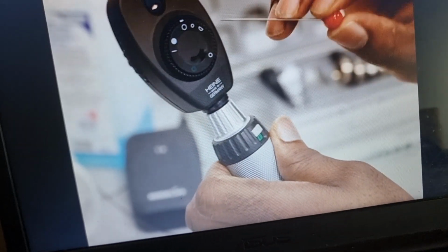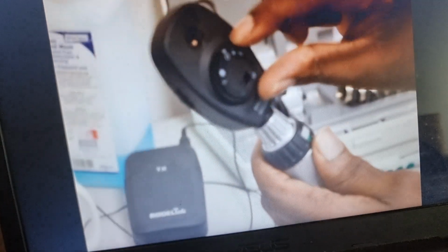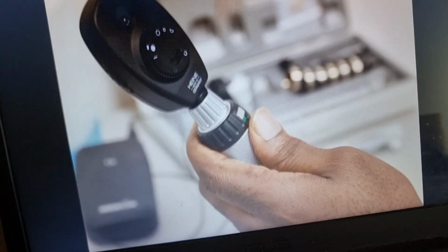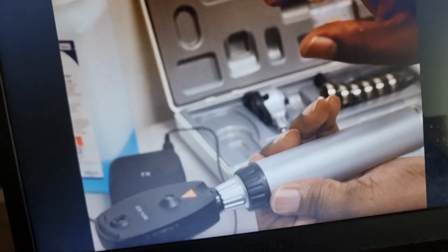Among the white lights, we have a light that looks like a half moon. I'm going to turn this down and move it. You see this white thing in here? You rotate this to choose. If this white thing stops in here, it will give us a slit light. Stop, look, as you can see, it's a slit light. Now, if I turn this one further up, it will give us a grid light, as you can see.